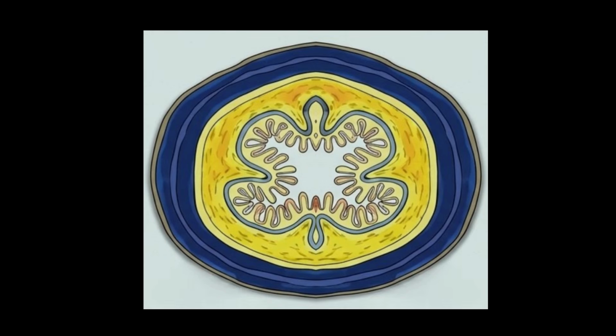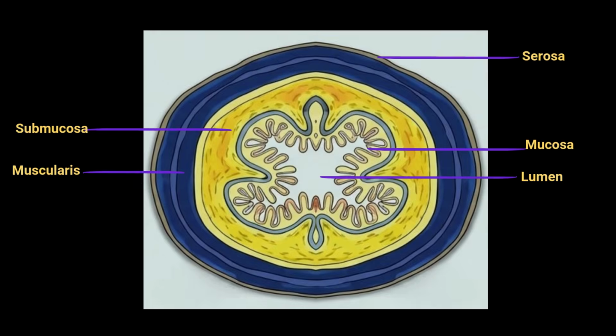The gut signature refers to the layered appearance of the bowel wall on ultrasound. The appendix has a classic gut signature made of 5 layers. You must know these layers and learn to identify them on ultrasound. This is very important, especially while looking for gangrenous or perforated appendix.